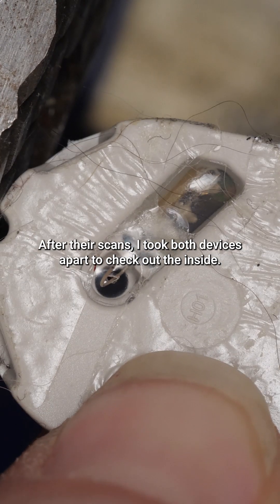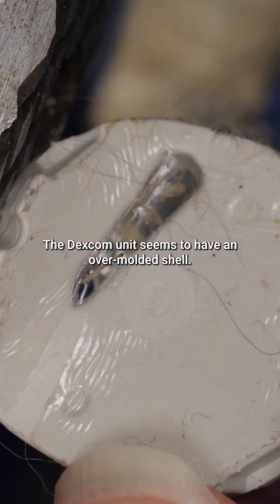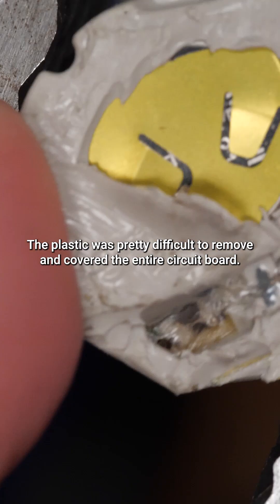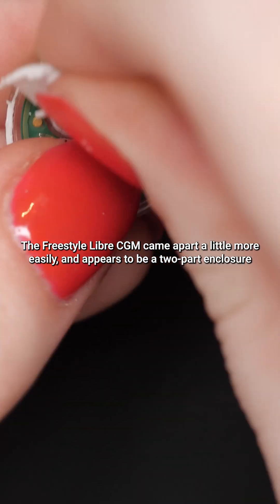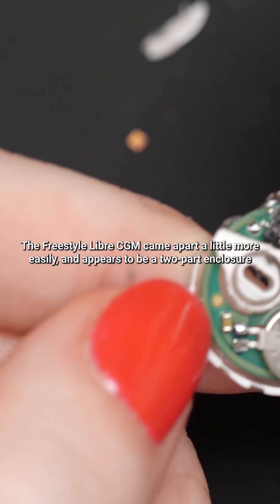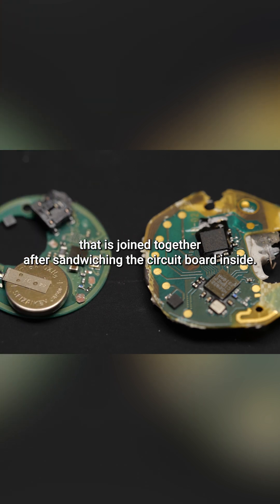After their scans, I took both devices apart to check out the inside. The Dexcom unit seemed to have an over-molded shell — the plastic was pretty difficult to remove and covered the entire circuit board. The Freestyle Libre came apart a little more easily, and appears to be a two-part enclosure that is joined together after sandwiching the circuit board inside.